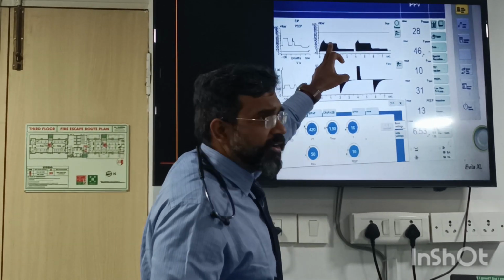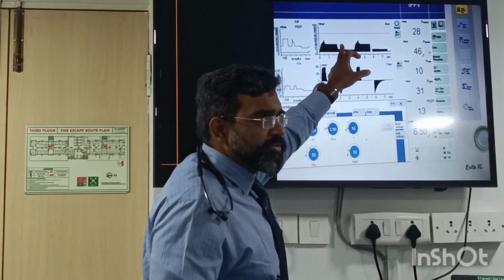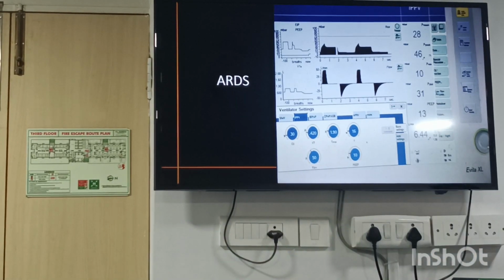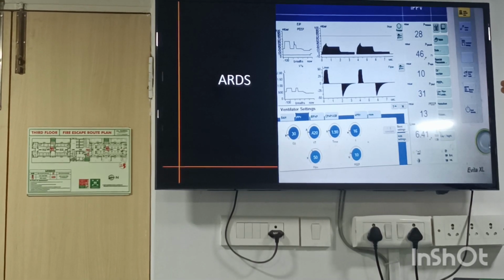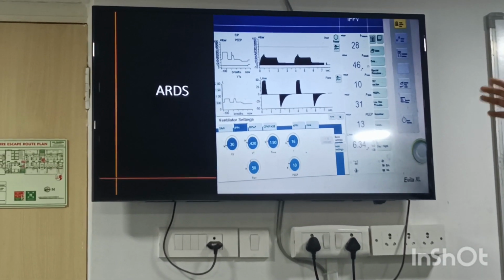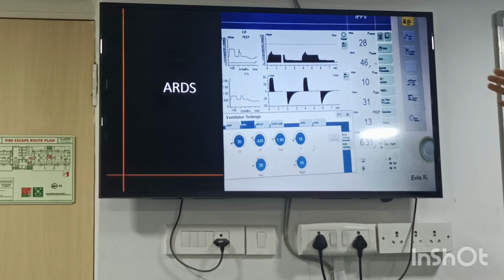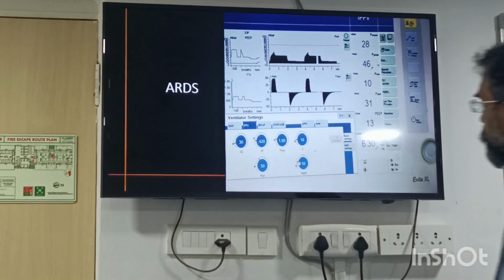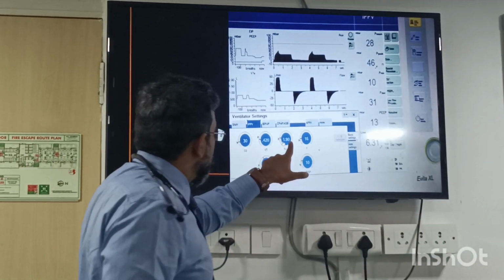It was cutting over here. Now it is cutting over here. So even more blackness. So oxygenation is further improving. Are you understanding? So more blackness means more oxygenation. So I made it 1:1. I have more oxygen. ARDS patient, I want to improve my oxygenation. This is what is occurring. I am looking at this. Okay. Now, what is my ratio?